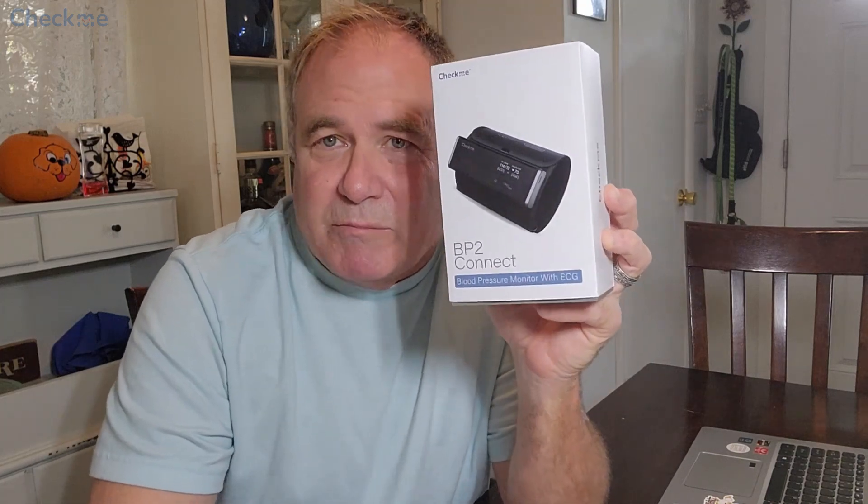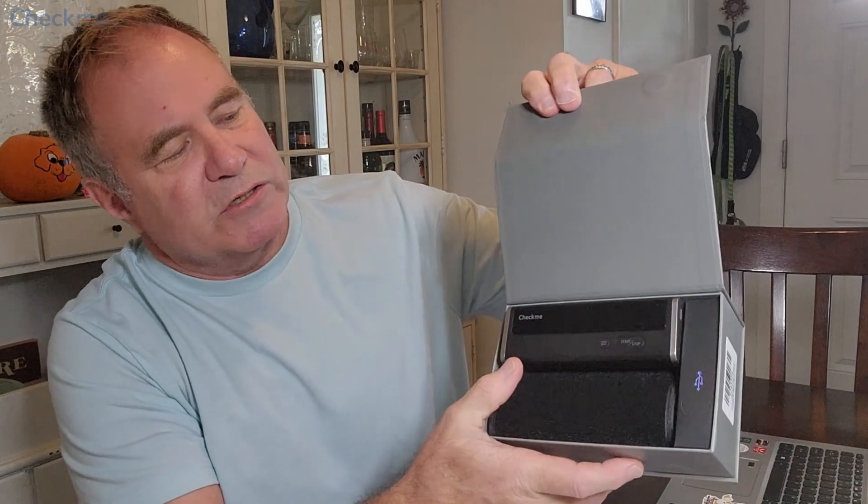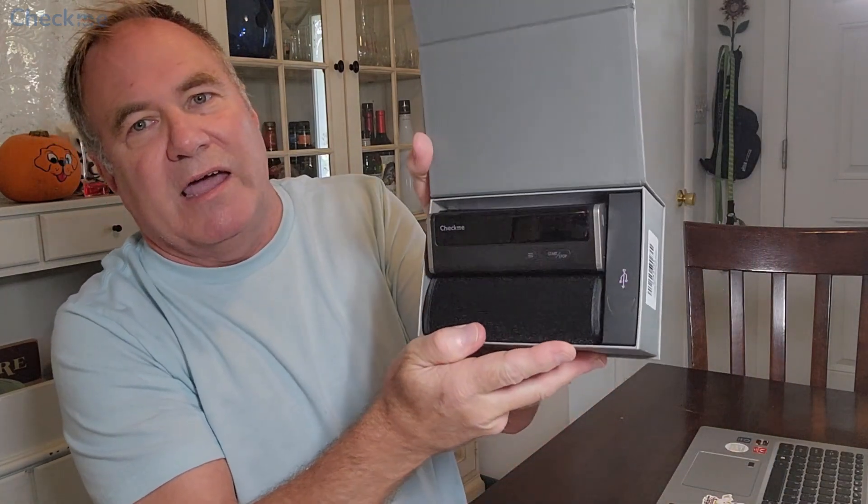Today I received my electric blood pressure monitor by CheckMe and I can't wait to unbox it, so let's do that right now. Let's see what we have in here. It looks like we have the monitor with the armband and the charger to keep this guy happy.